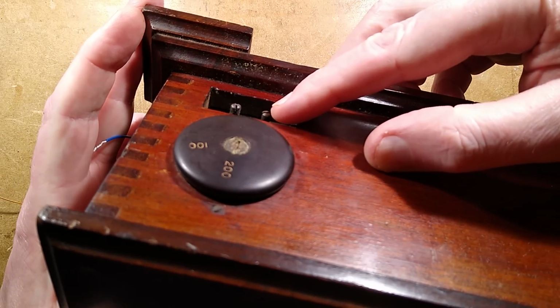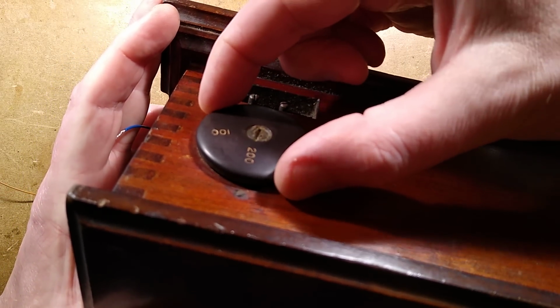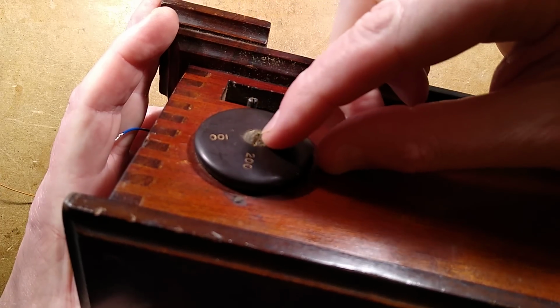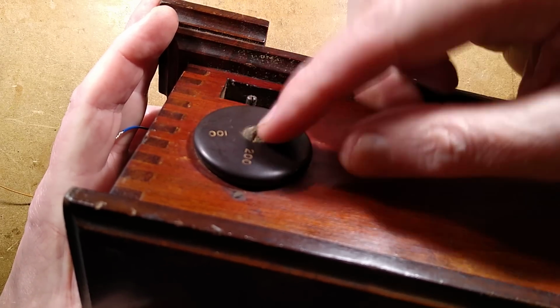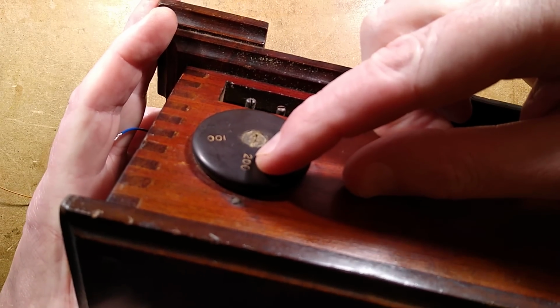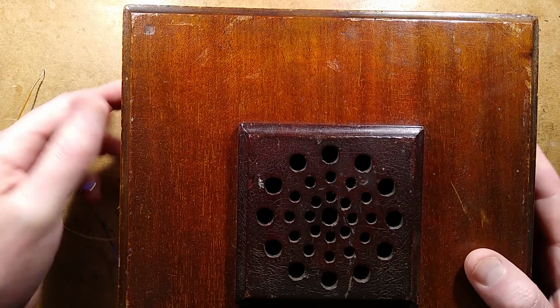There's the input socket, well, plug, on the side, and there is the polarity selection. I thought this twisted originally, but you take this screw out and then you turn it round and then you put it back in. It's pluggable links, 200 volt-ish and 100 volt-ish, AC or DC. I think it certainly works in AC.